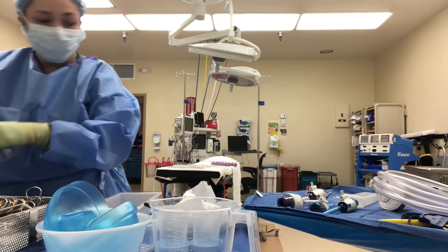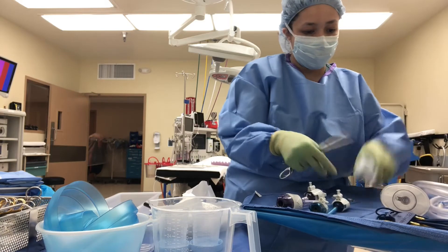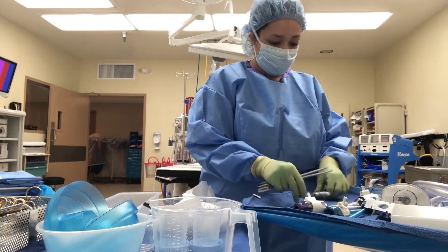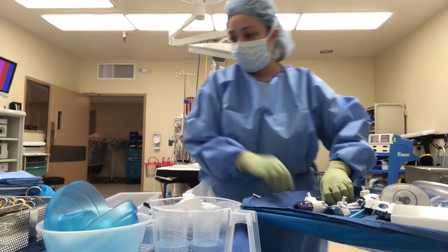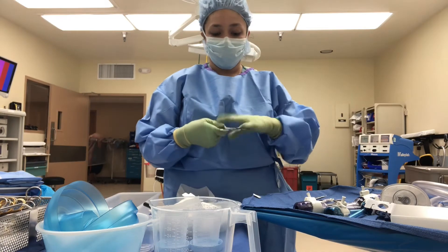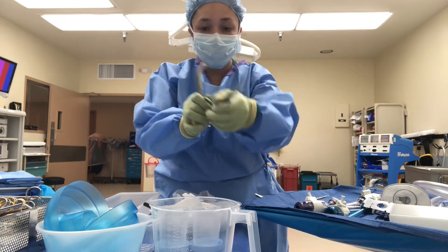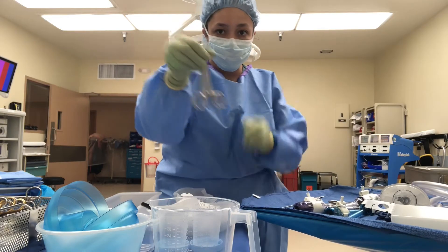Now I'm going to be setting up my Mayo stand with the instruments I'm going to be using. I first put up some Kochers and some penetrating towel clips, which are used to bring the fascia up and insert the Veress needle, making sure the Veress needle is in the proper position and you're getting gas into the proper area of the abdomen — not just through the skin, but into the actual cavity.